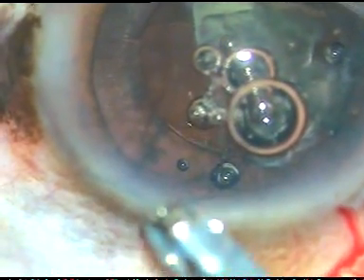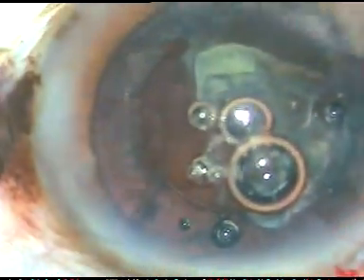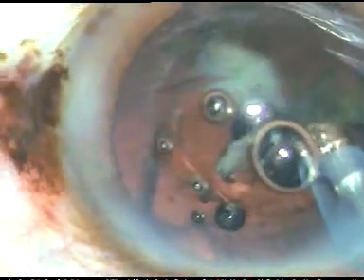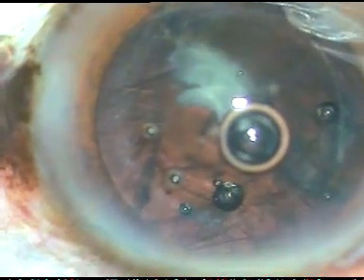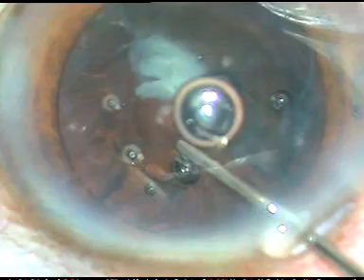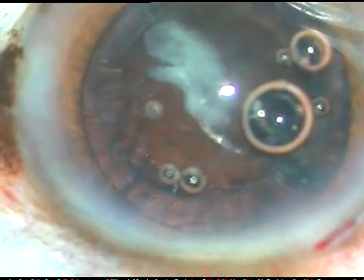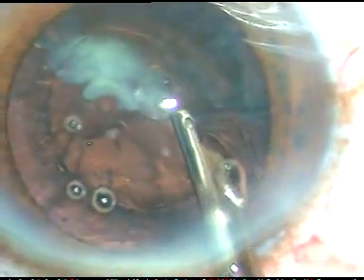The Viscoat has nicely plugged the rent. And now, here it is. I go in at phaco 3, that is epinucleus mode of the Oertly phaco machine. Phaco power is only 20%. And now I want to inject some more Viscoat. And I want to bring the other epinuclear piece towards the center. Yes, I am mobilizing this. And I make it free.